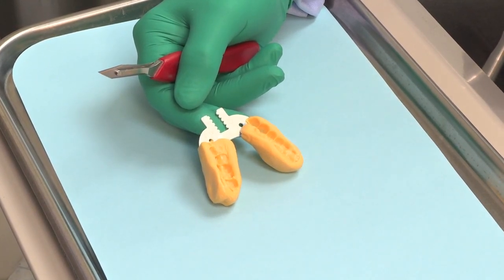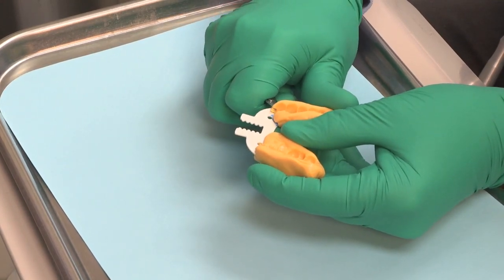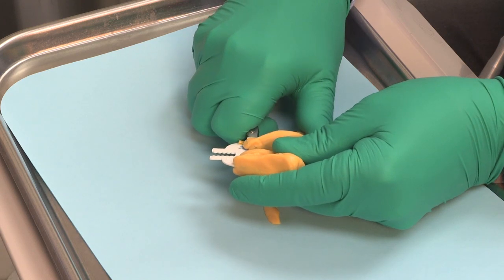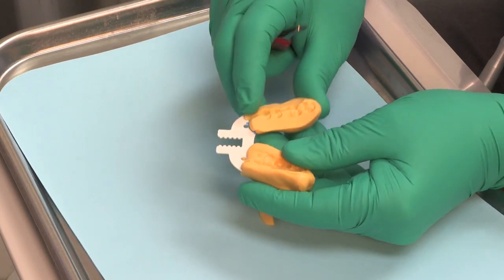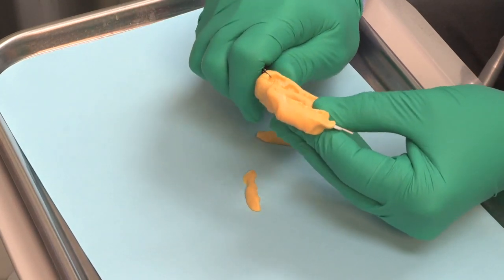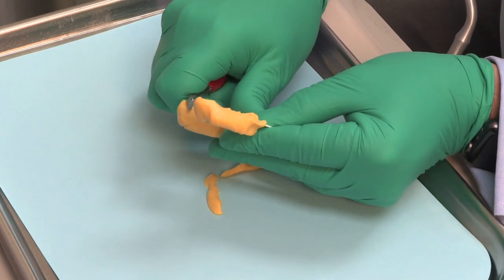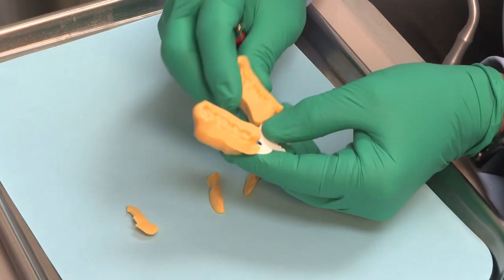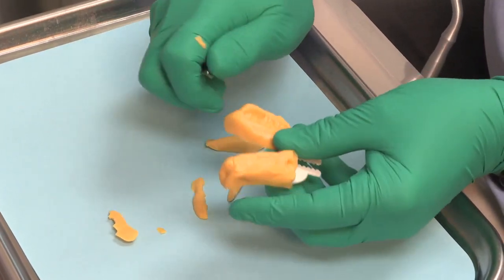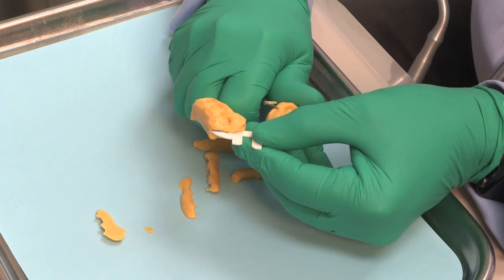But I'd like to trim this like we would with a crown and bridge impression. So we're going to take a Bard Parker 25 blade, and basically the only thing you want left in the index would be the cusp tips. So using the 25 blade, I'm trimming the Panasil putty back so that we have cusp tips left in our putty only. And then once done, we will reseat this, verify the midlines, and we'll talk about the midline once we get it reseated. You can see it doesn't take a lot to trim this. And we have some nice representation of our cusp tips in here.